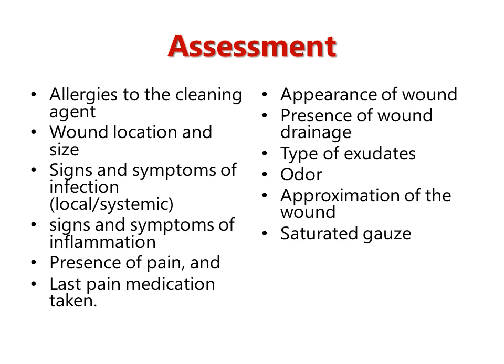And the next assessment would be to check if the gauze is saturated or not. Saturated means it is full of exudates or blood or not. Again, I'm going to show you what a saturated gauze looks like.